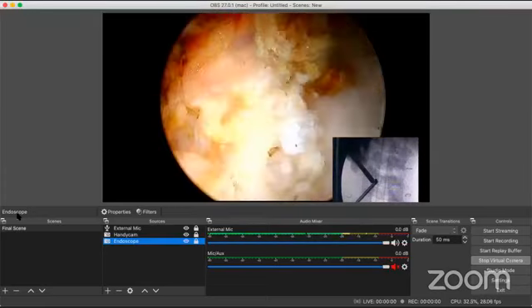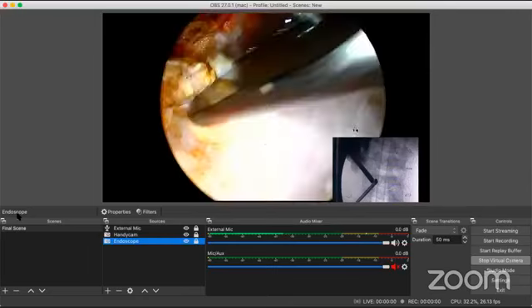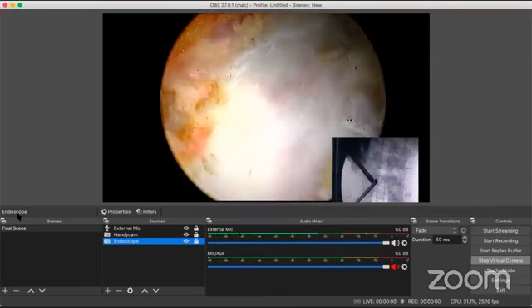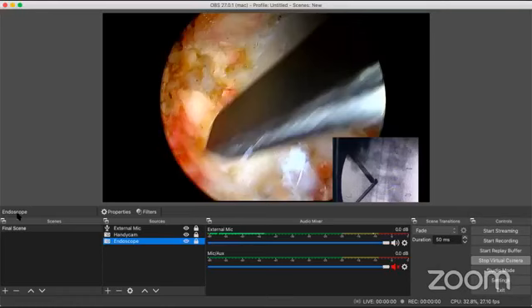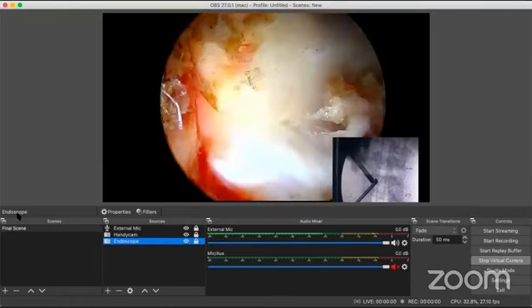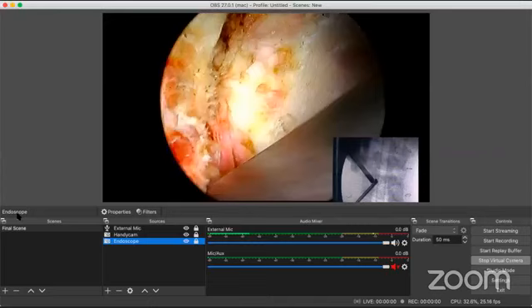A little bit of loose dissected tissue, which looks big, but is actually very small. Small amount, it can hardly be seen. But when it disturbs you, it disturbs you badly. And the problem is this tissue. This tissue is always there. And this tissue needs to be stripped slowly, slowly, slowly. Okay, now.